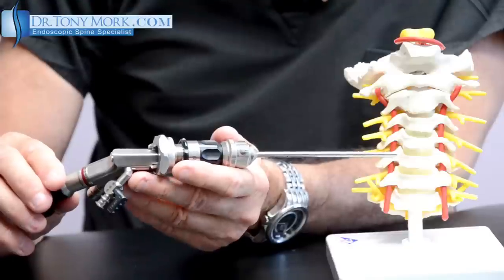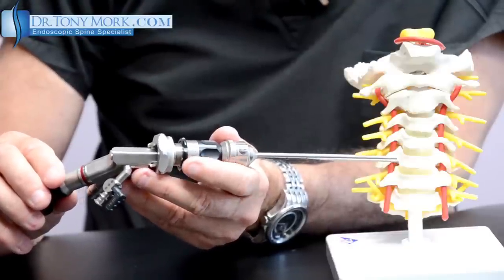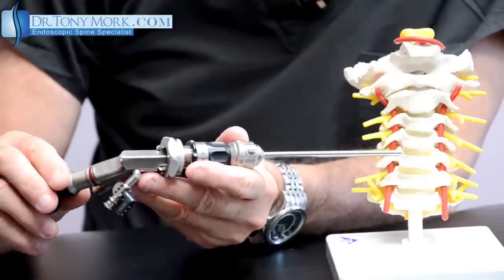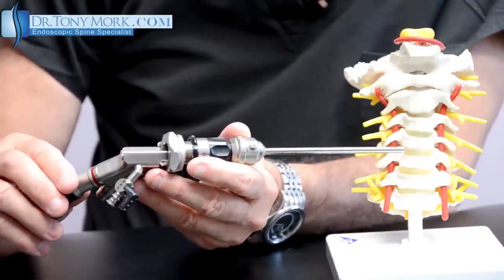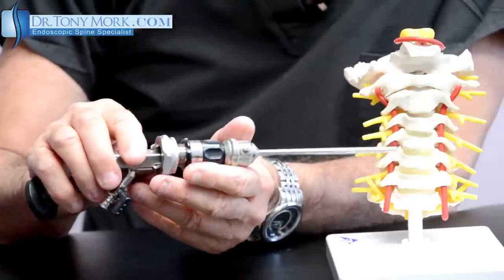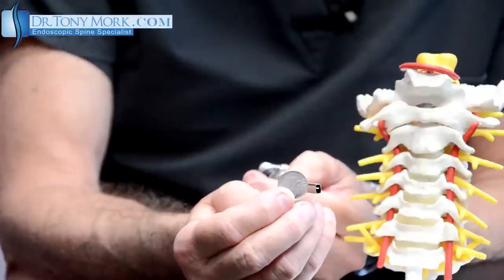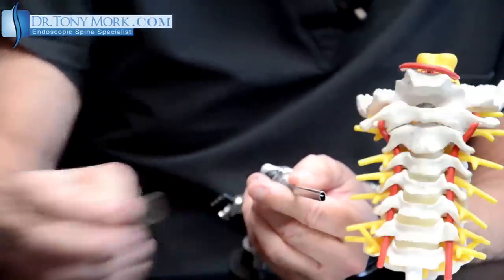Having the instrumentation be this small allows this type of procedure to be done under conscious sedation with really minimal discomfort. A patient can leave within usually 40 minutes to an hour after the procedure. You can see the incision is between an eighth and a quarter of an inch maximum — look at it compared to the dime, how small this is. So this is an easy outpatient procedure that really replaces the fusion-type operation with its significant increase in morbidity and long-term recovery.